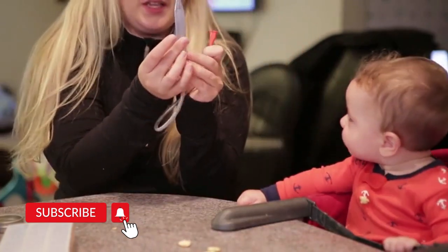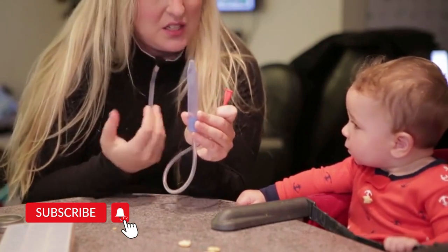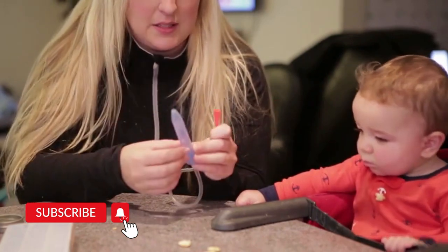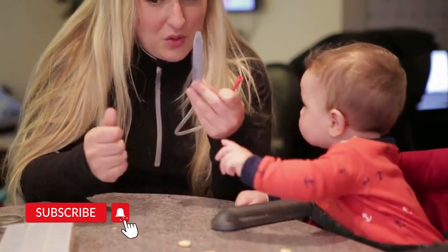I can't really tell, but there's definitely a bunch of gunk in there. Since babies don't know how to blow out, it definitely is nice. Just make sure that you clean it.